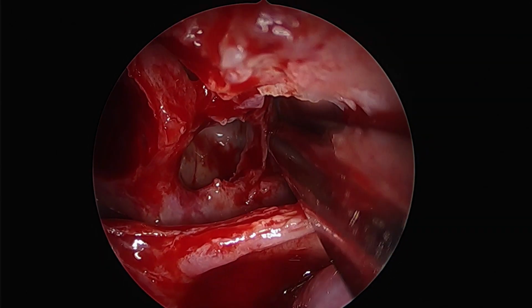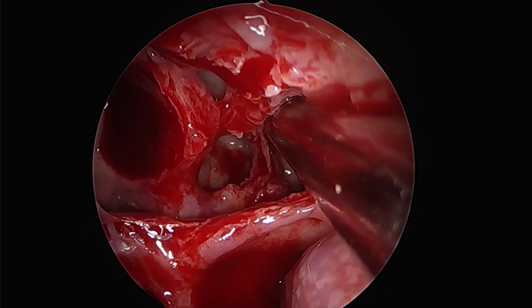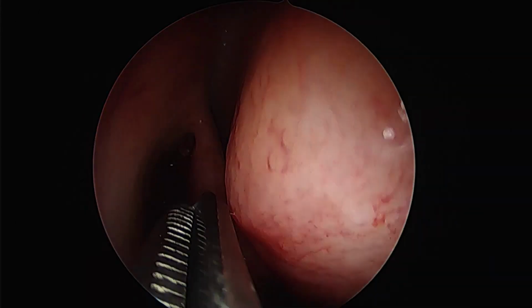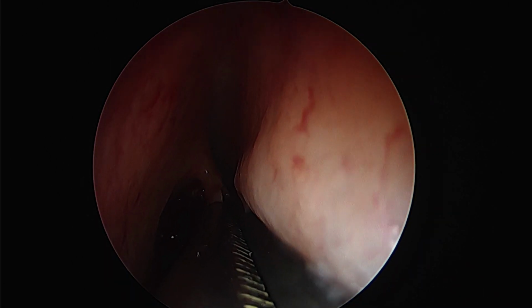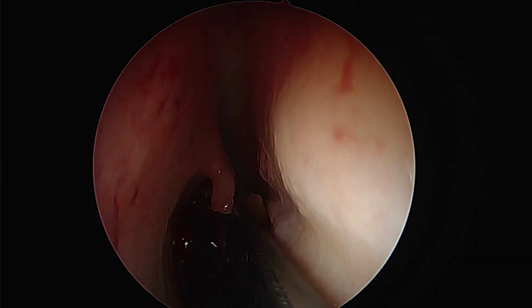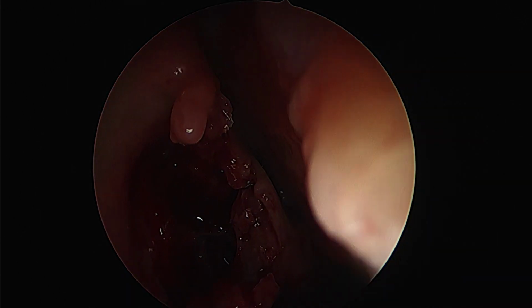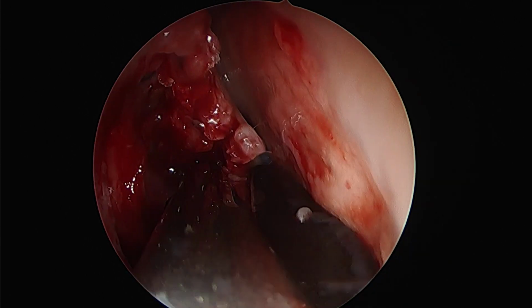Most skull base leaks are a very good opportunity for a complete ethmoidal and paranasal sinus dissection. As the sinuses are clean, they are normally devoid of any disease, and one can proceed from cell to cell, dissecting the entire sinus framework. Once a basic ethmoidectomy and antrostomy have been completed and a sphenoidotomy has been done, we proceed to removing the middle turbinate. We excise it right from the attachment to the axilla while continuously pushing it down.